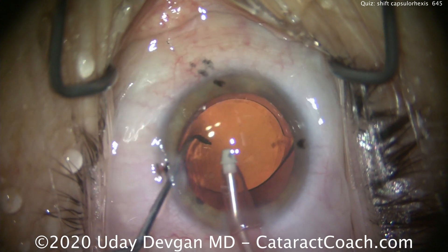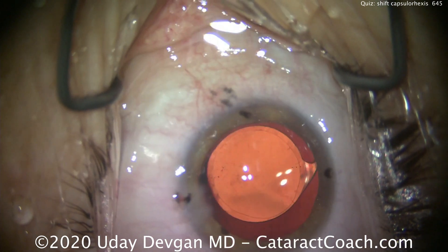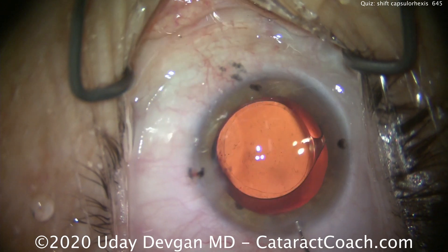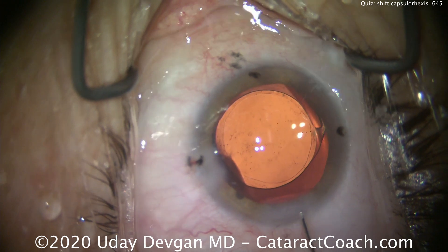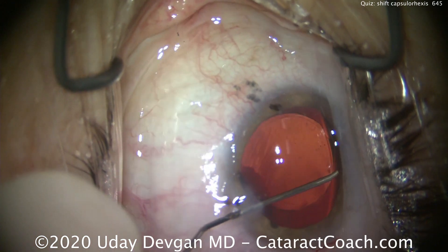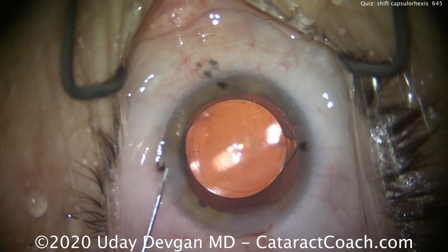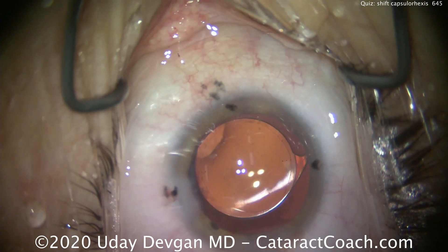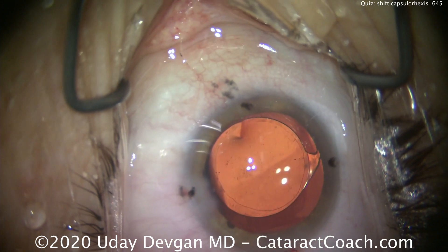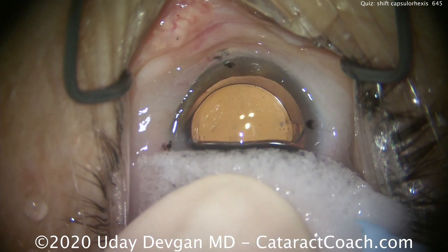You can see there are also some alignment marks on the cornea for guidance. The black marks are one set of ink marks, but look at the anterior cornea just above the haptic-optic junction — there are stromal puncture marks there to mark the appropriate axis. Here we go sealing up the incision now with a balanced salt solution. Do a little angle sweep. When we line up the Purkinje images — there we go. We have placed the IOL and the rhexis slightly nasally in this patient in order to line both of them up beautifully on the visual axis.